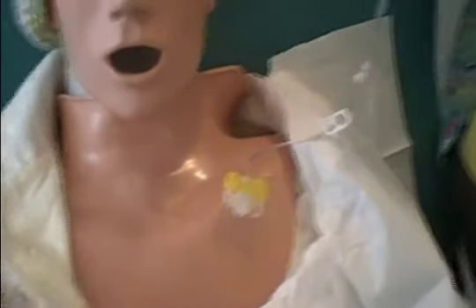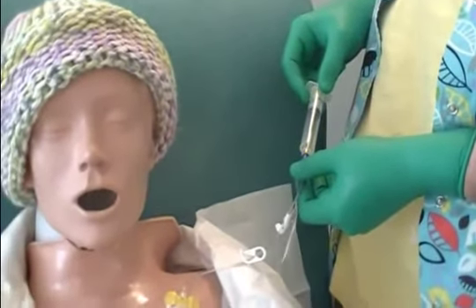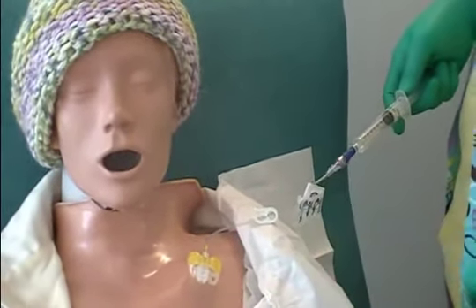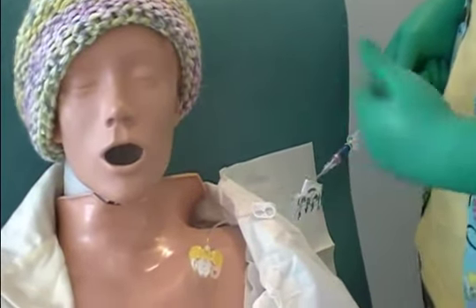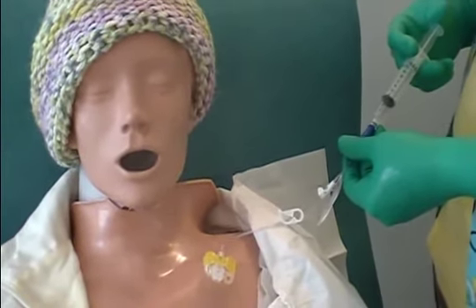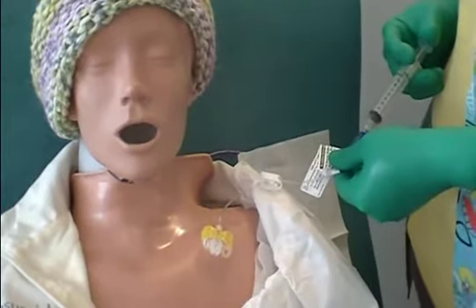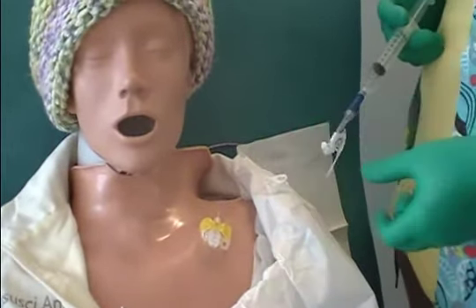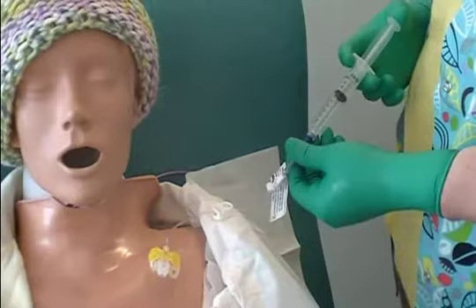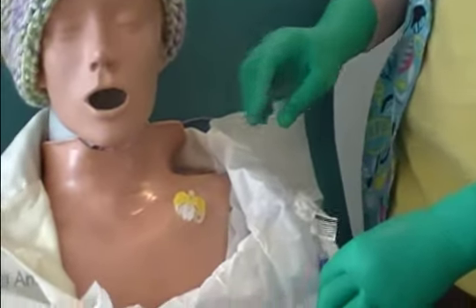You only use a 10cc syringe — nothing smaller — on the port tubing. I'm going to try to flush a little bit; if it flushes fairly easy, I'll go ahead and flush a few cc's. Then I'm going to pull back to see if I can get blood return. If I got blood back, I'll go ahead and flush this back down in. I tried to flush but it wouldn't go because I hadn't unlocked it — see how good those locks are? But I drew back and got blood. Now I'm going to lock it again.